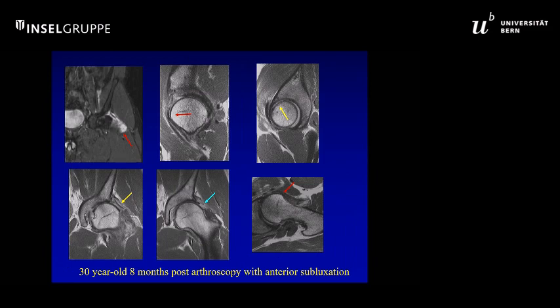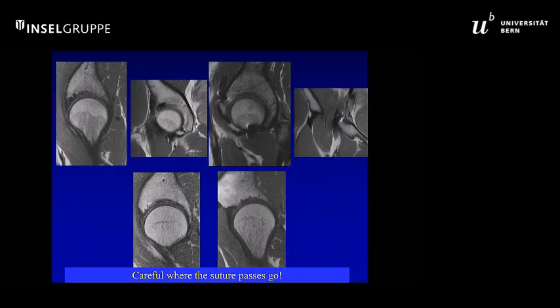Similarly, in this patient, you can see there's gross disruption of the capsule, and this is why I really like non-contrast techniques, because I want to see that native capsule and the presence of extracapsular soft tissue edema. You can see the anterior translation of the femoral head, and you can also see that, unfortunately, there's full-thickness cartilage loss there by the yellow arrows with a big fragment in that lateral recess. So she's delaminating cartilage pretty actively. Deficient iliofemoral ligament with a blue arrow, and that anterior translation with the red arrows.